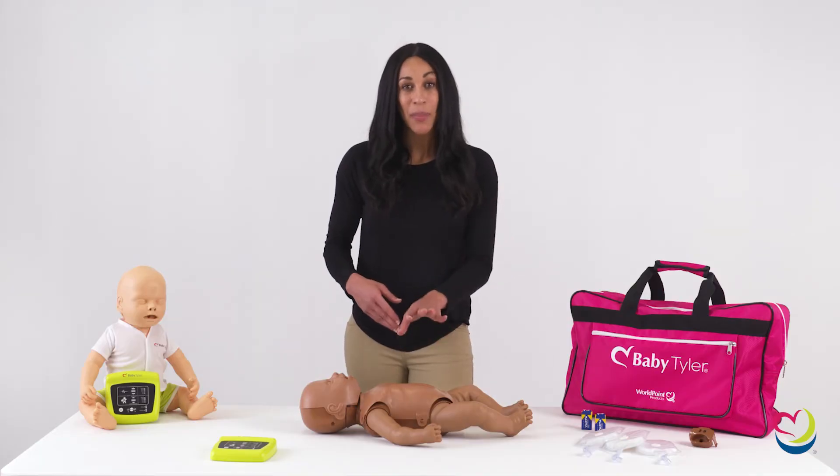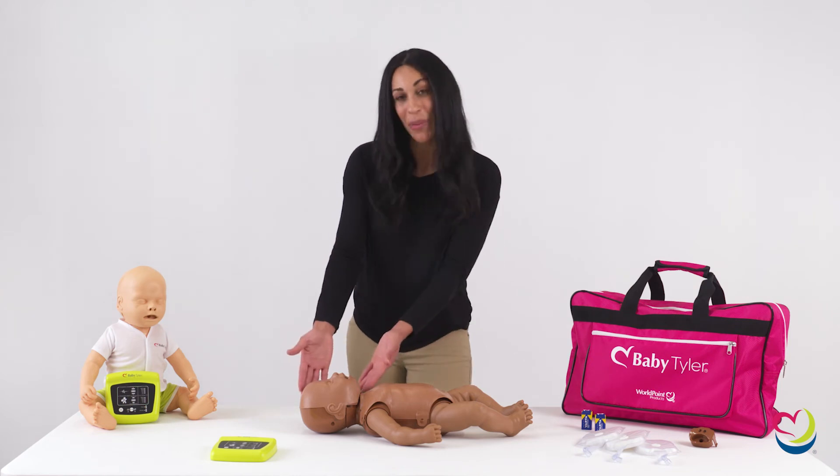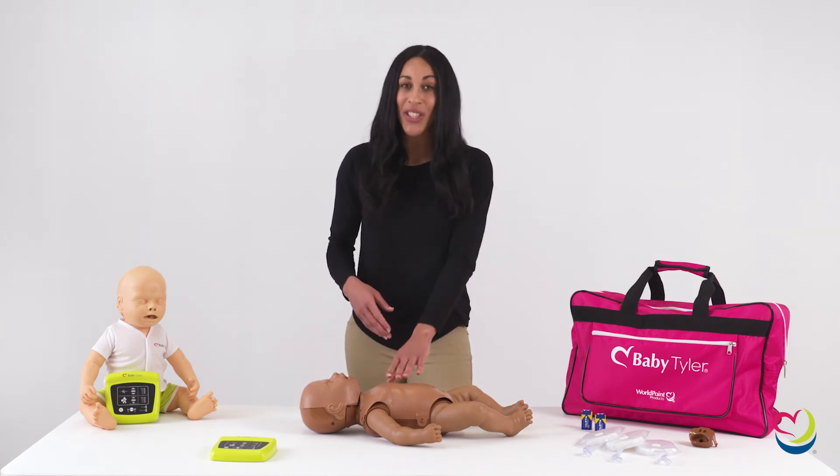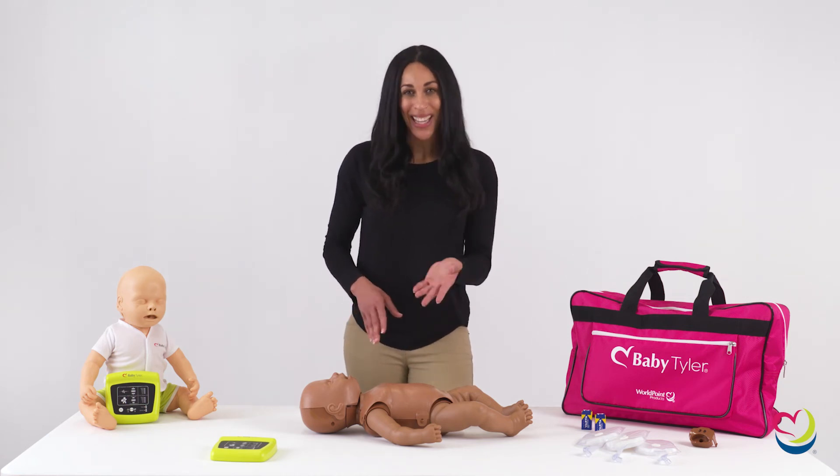A quick tip: if the chest stops rising during a practice session, first check the face skin to ensure that it is fit properly. Next, check the lung to see if it is moist. If the lung is moist, replace it with a new one and get back to training.